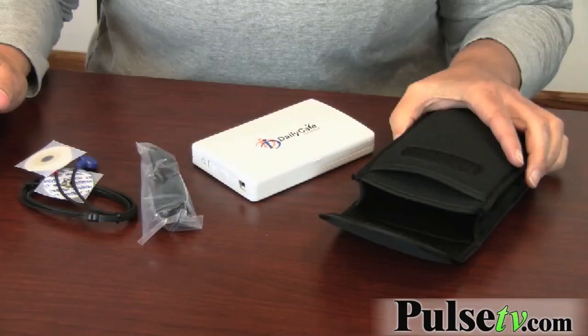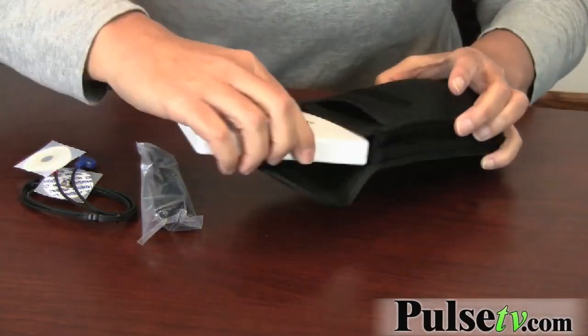These retail for up to $300 — this particular unit retails for $250. Our price is below wholesale cost, and it comes with this nice little carrying case.